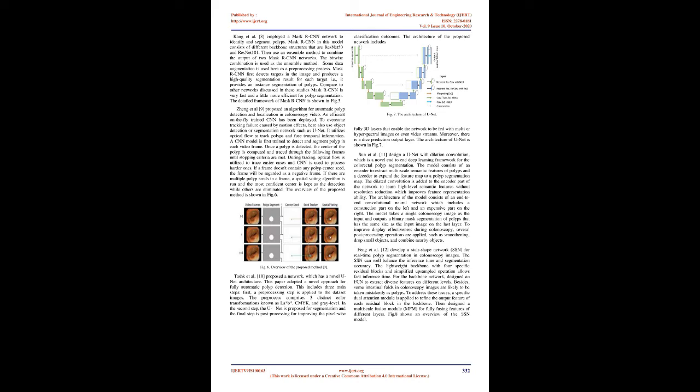The long short-term memory network, LSTM, preserves information for long periods. The memory cell is changed with the input gate, forget gate, and output gate. The forget gate decides what information to throw away from the cell state. The input gate decides what new information to store in the cell state. The output gate decides what to output. The LSTM can remove or add information to the horizontal path, which ensures keeping important information for a longer period. In DeepLab v3, the ResNet, multi-grid methods, and the ASPP acquire different information.